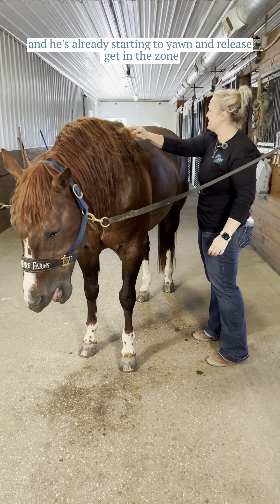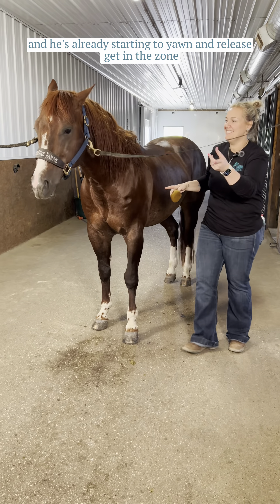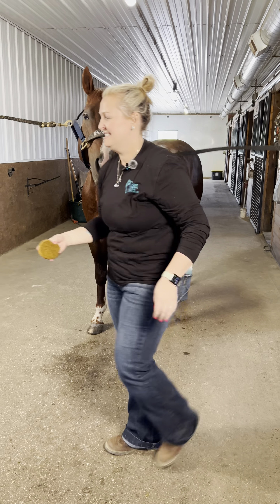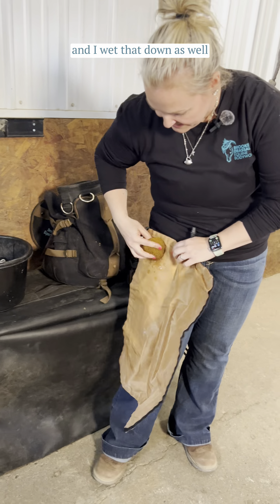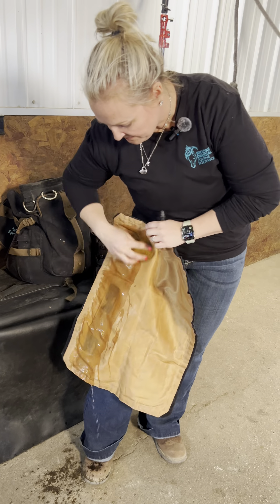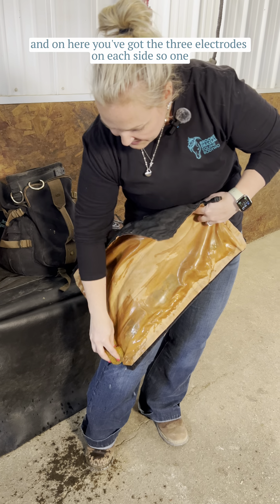He's already starting to yawn and release, getting into his zone — he knows the drill. Then I'm going to take the pad for the FES and wet that down as well.